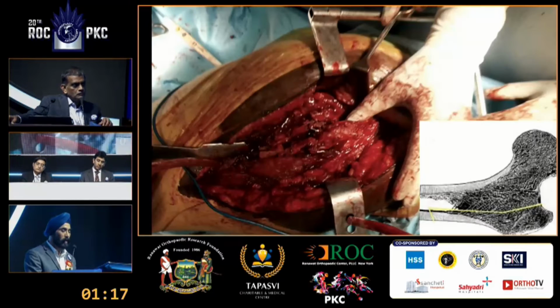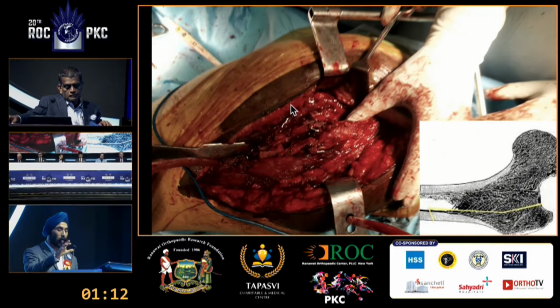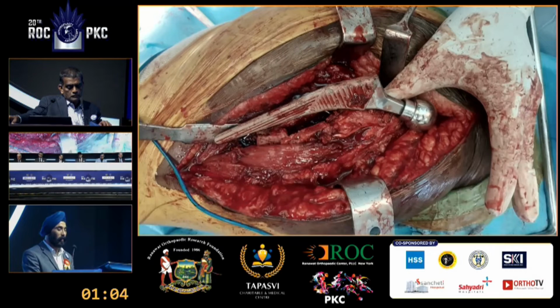Yeah. So exposure essentially would need an osteotomy. We had to lift the abductor mechanism with a short osteotomy because there was already a small fracture there. We actually elevated it up, and that's how you are able to reflect it up. We were able to remove that stem with that skirted head out there.